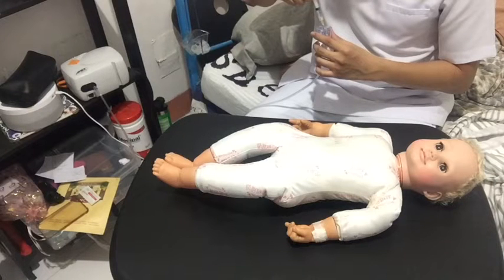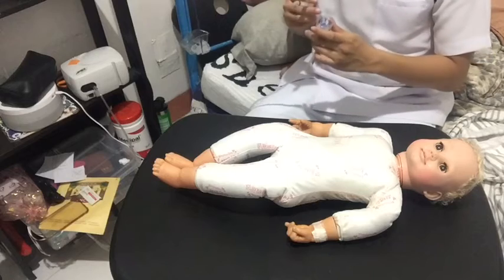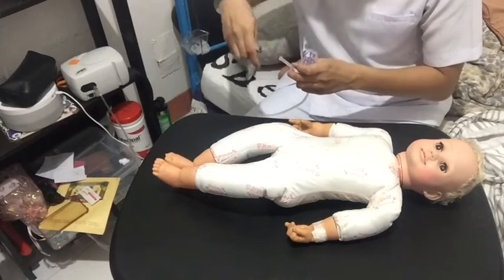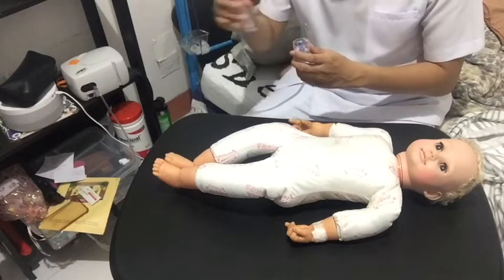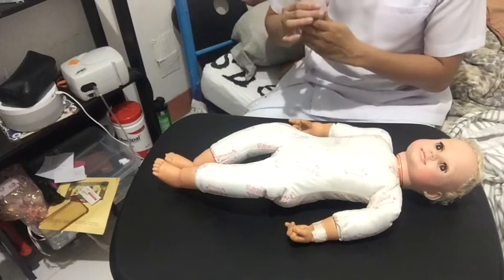We're going to be putting in the medication as prescribed by the doctor. We don't usually use needles, but there's a certain solution needed, so let's just make a shift. We're going to have to put it there.